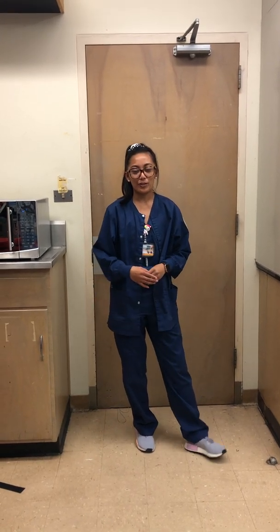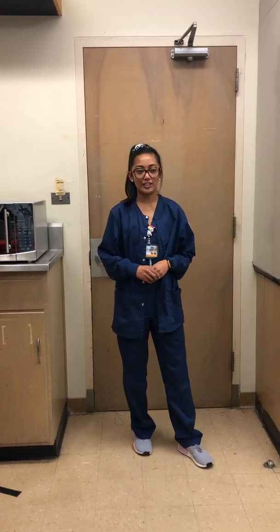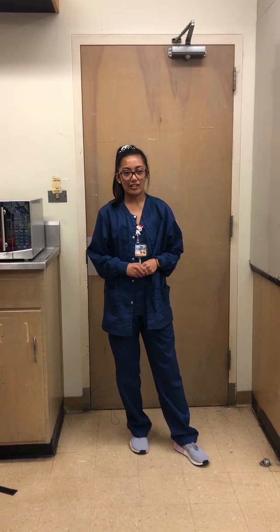Bernie, and I'm going to be doing my metered dose inhaler competency. So today, before entering the patient's room, I would check the patient's medical records to see if any of that would help with the assessment today, and if there's any information that I would need to know prior to entering the room. Also, I would check for any PPE requirements, which there are none, and also the physician's orders for what I will be doing today.